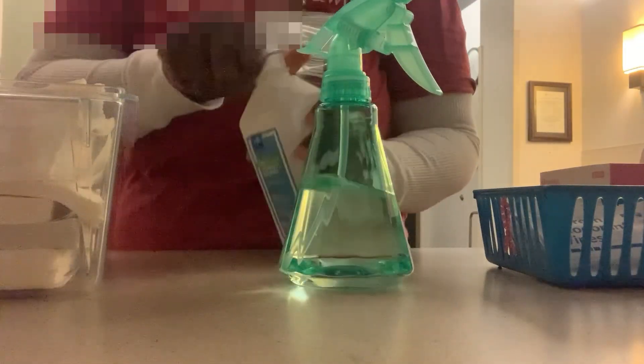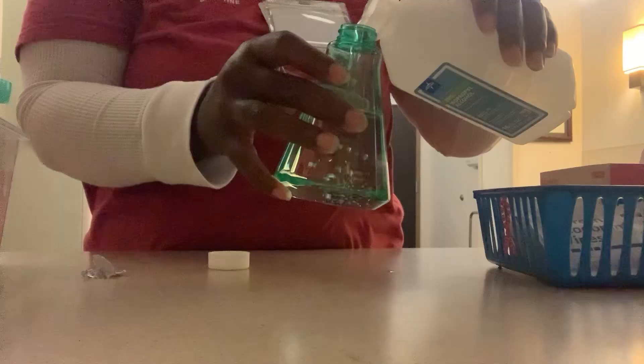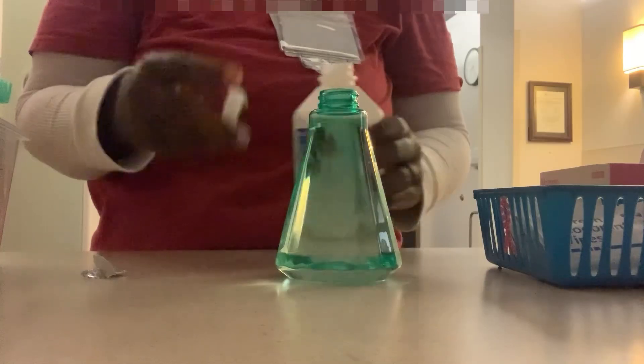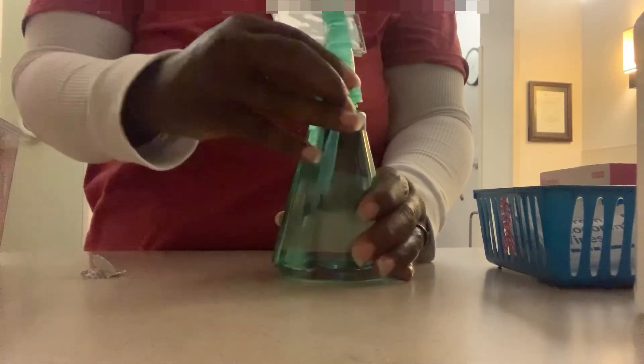I'm filling up the alcohol bottle because this is what we use to help clean the machine. We spray this solution on the machine before and after each patient to make sure the machine is clean. I make sure that I wear gloves with every patient I come in contact with, and I wash my hands and use hand sanitizer frequently — just getting everything ready for the day.